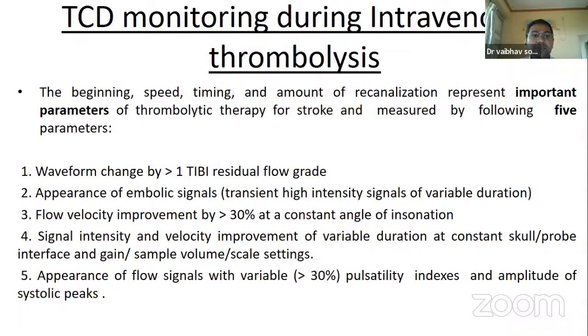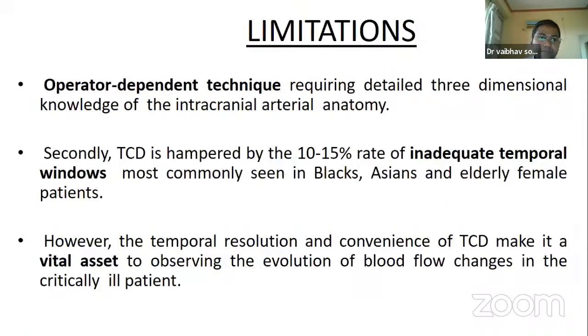Second thing, is any microemboli signal present or not? Then, appearance of flow signals with variable pulsatility index and amplitude of the systolic peaks. These are the 5 parameters that we have to monitor while doing intravenous thrombolysis with TCD monitoring.